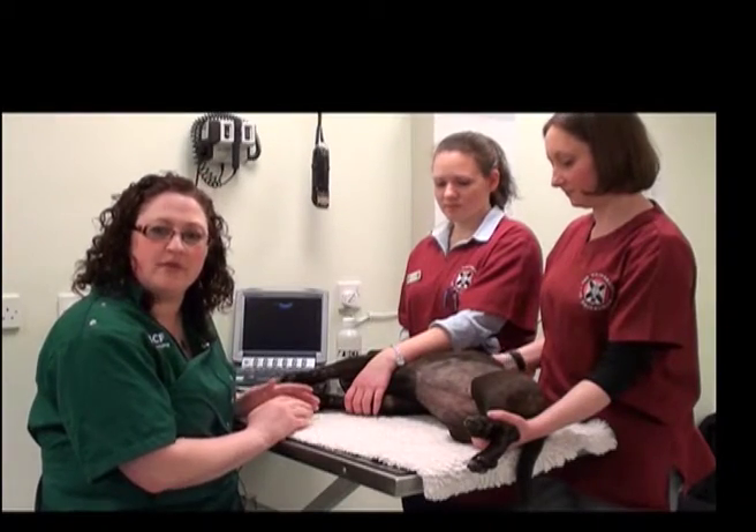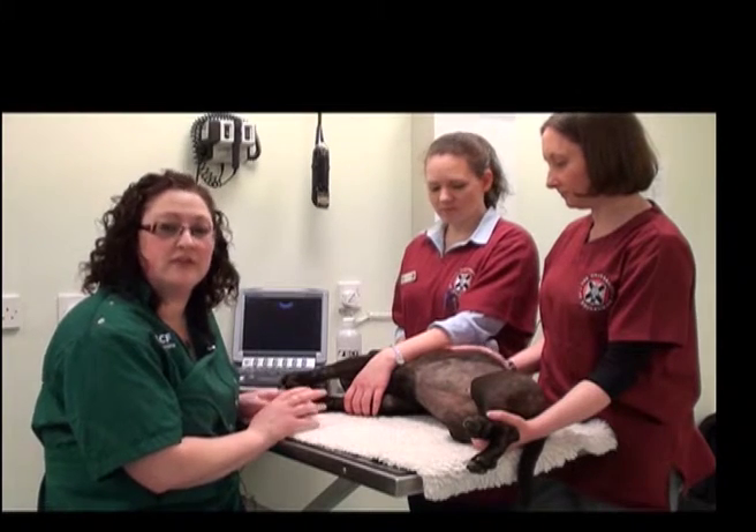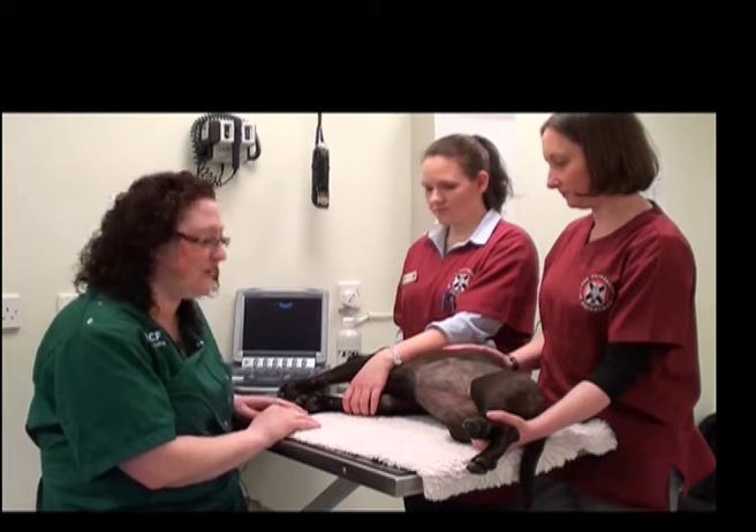It's very important when performing an abdominal ultrasound examination that you really take care to make sure your patient is as comfortable as possible. It will really help to make your exam process a lot easier.